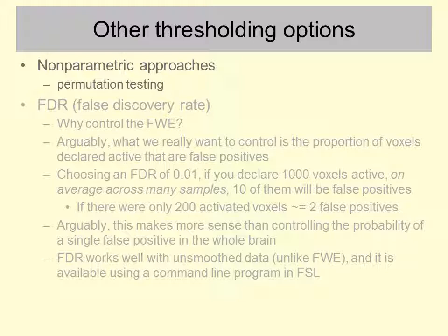And if we calculate all the possible shuffles that there could be of the data and all of the statistics for means and standard deviations for each set of shuffles, then we can build up a distribution of what the results look like when the null hypothesis is true, and therefore what percentage of them have real differences that are equal to or exceed the one we observed with our actual group memberships. So that approach can now be used in neuroimaging. It is quite computationally intensive and tends to take a while, but it is a good idea under some situations such as small sample sizes.